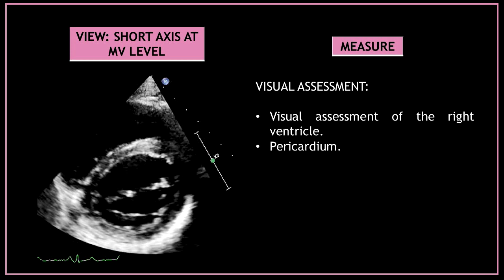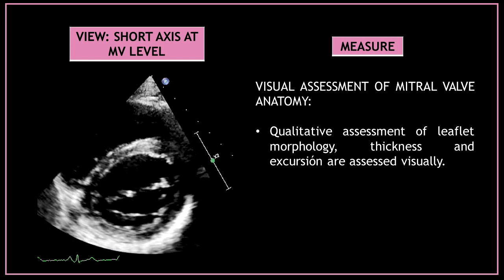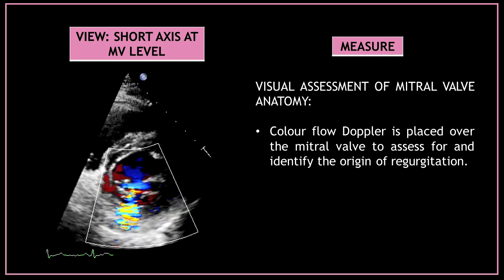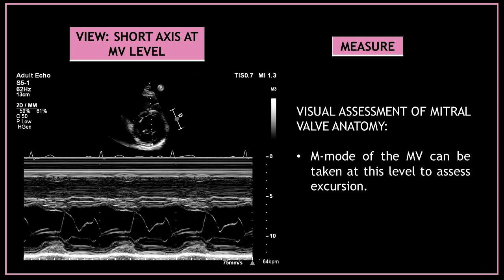Now perform a visual assessment of the right ventricle and the pericardium. This is a very good view to do a visual assessment of the mitral valve anatomy — analyze the leaflet morphology, thickness, and excursion. Place color flow Doppler over the mitral valve to assess for and identify the origin of regurgitation. You can also use M-mode at this level to assess the mitral valve leaflet excursion.